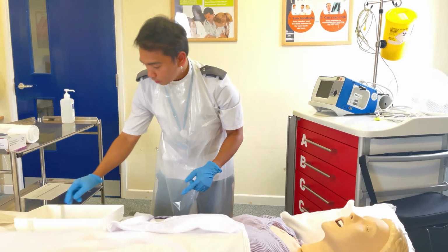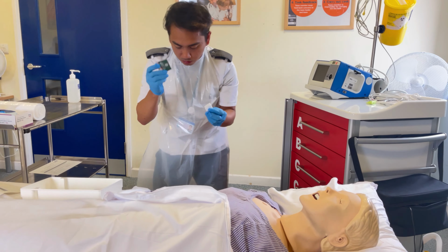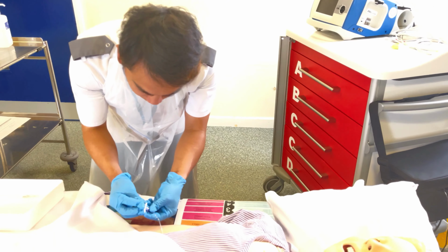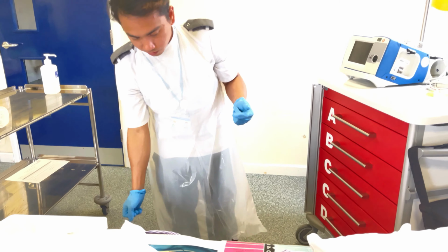So first thing I'm going to do is clean the port for 30 seconds, and dispose of it in the clinical waste bin. So I'll just have to unlock it. I'll clean it for 30 seconds, and let it dry for another 30 seconds, and I'll dispose of it in the clinical waste bin.